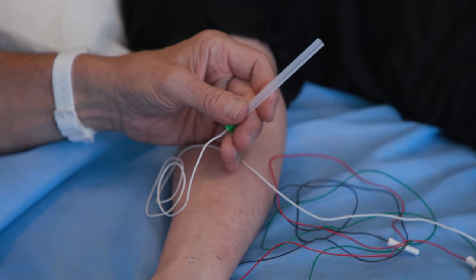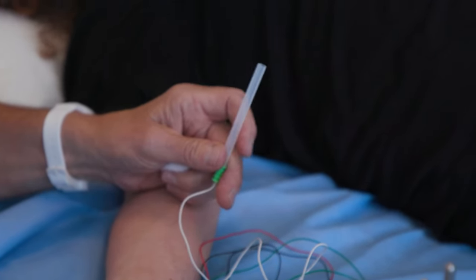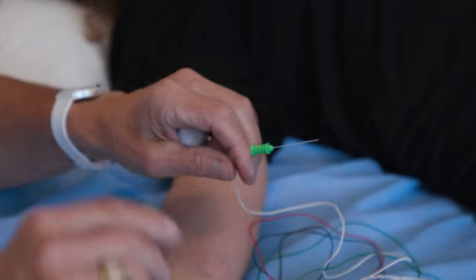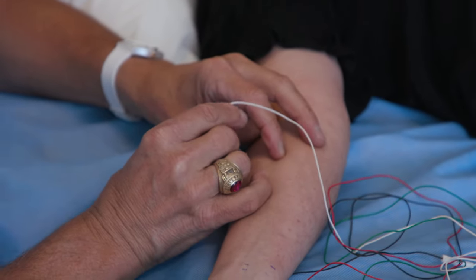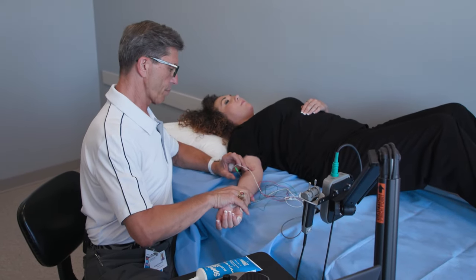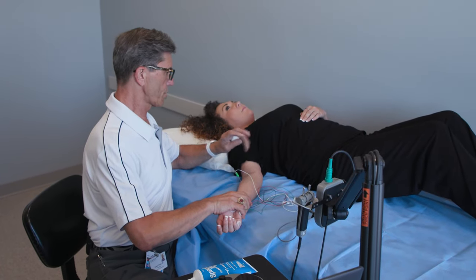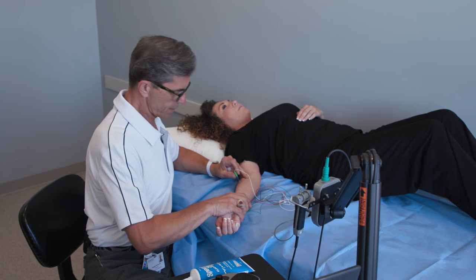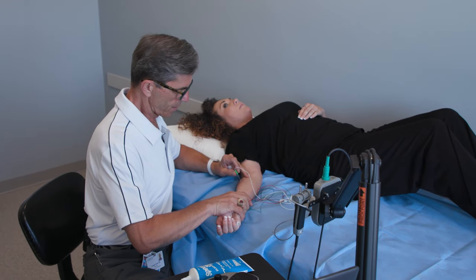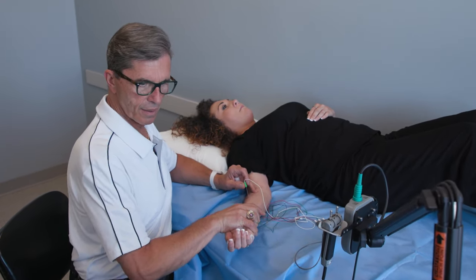We're just going to get everything set up here. You'll feel a pinch in just a moment — I will let you know exactly when. A little tiny pinch — ready? And noise as promised. Now what I'm going to ask you to do is push back against my arm, but only as strong as I push against you. Just go ahead and push up against me. Perfect. Excellent job — that's one down.